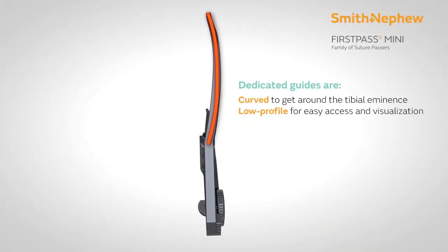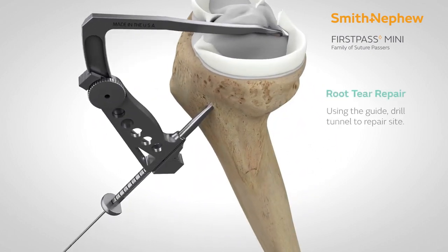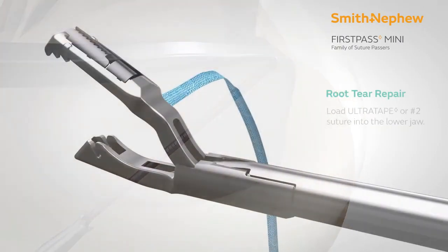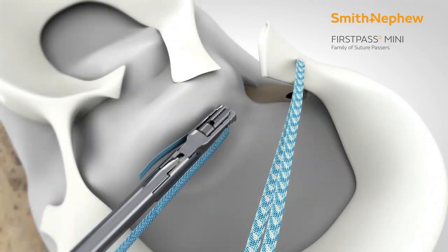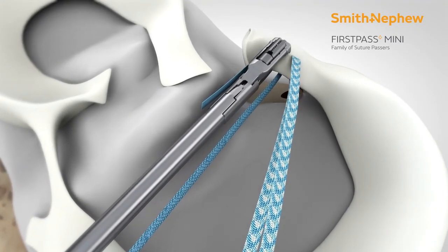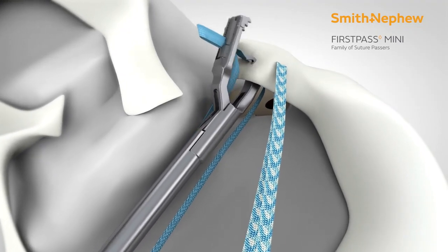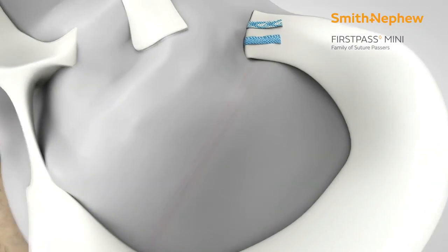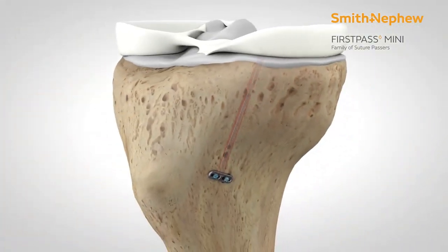The bites taken can then be repaired with a meniscus root repair jig, which comes with the system. This device can be used not only with sutures but also with tapes, and you can use the tapes to conventionally repair the meniscus root with a pull-out technique, tying it over the suture button on the tibial cortex.